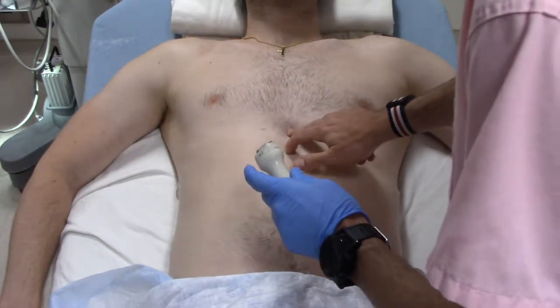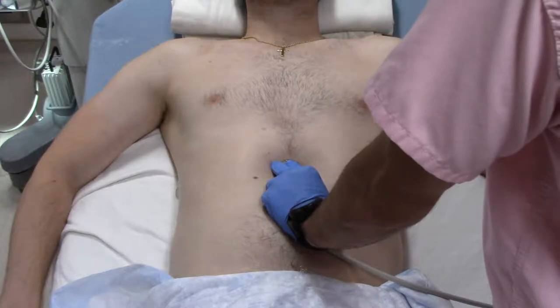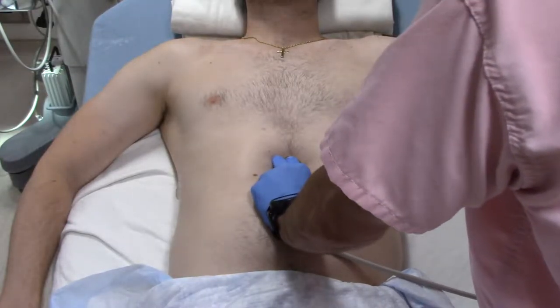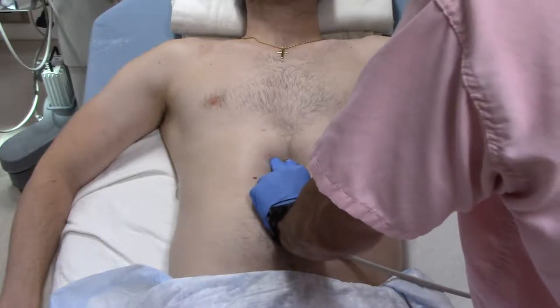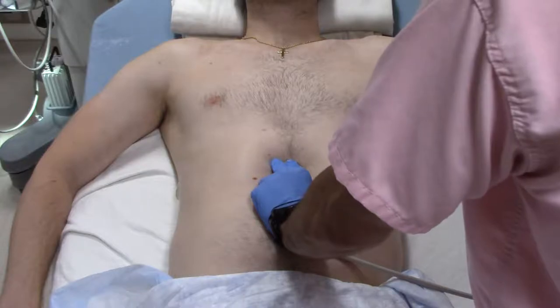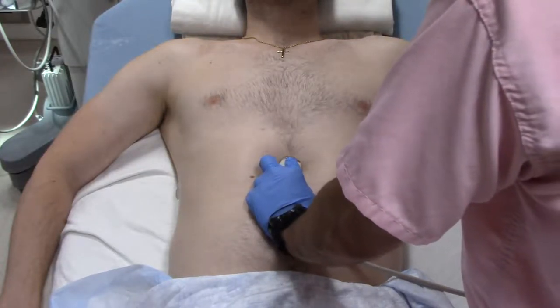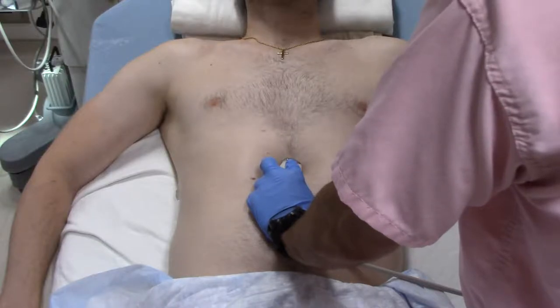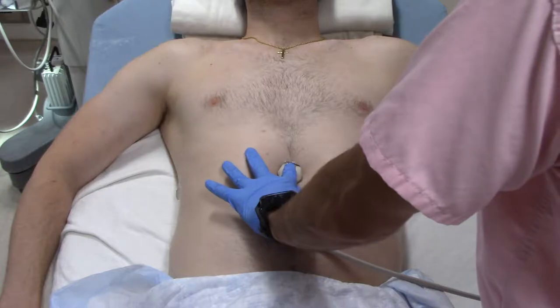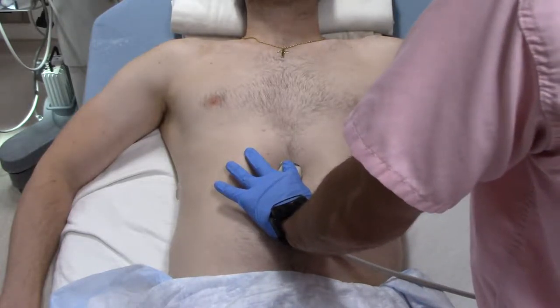Indicator stays pointed towards the patient's right, coming down just a couple centimeters onto the patient. Usually have to increase our depth just a little bit. Seeing that posterior pericardial line angling up there, using our liver as our acoustic window. We're going to acquire a clip there. Note that our grip has changed from a pencil grip to an overhand grip, really just pressing the transducer flat against the patient's abdomen — not applying any pressure into the xiphoid process at all. This should not be painful for the patient.